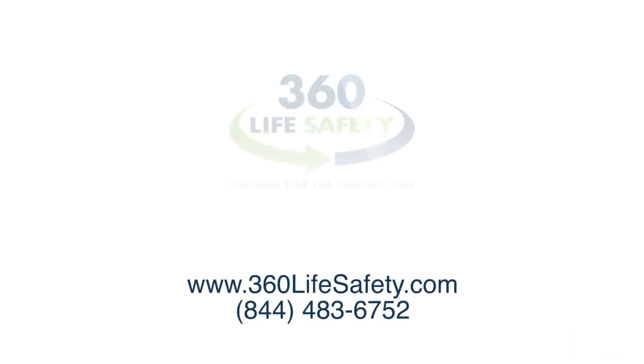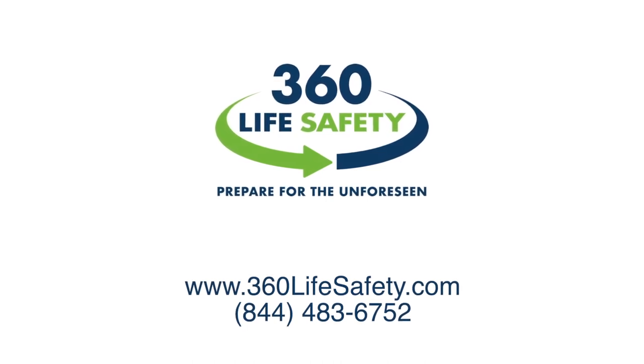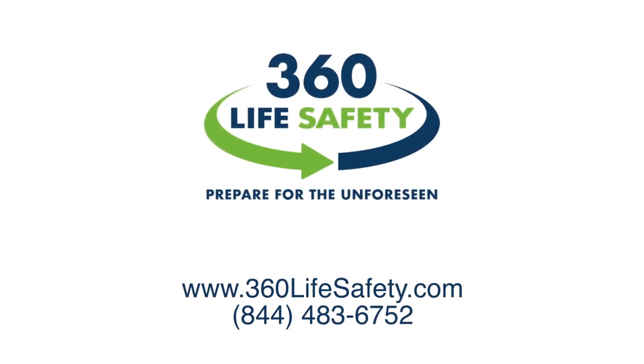So this is our amazing compact 92 piece First Aid Kit helping you, as always, prepare for the unforeseen where you learn, work, play, and pray. If you want to check out the rest of the items in this kit more in depth, you can go to www.360lifesafety.com.